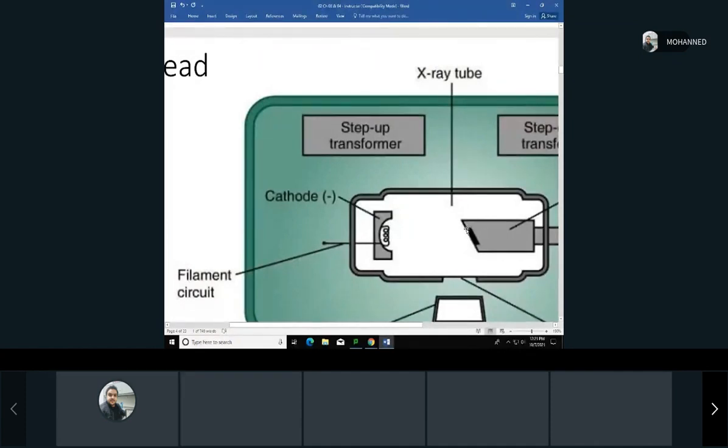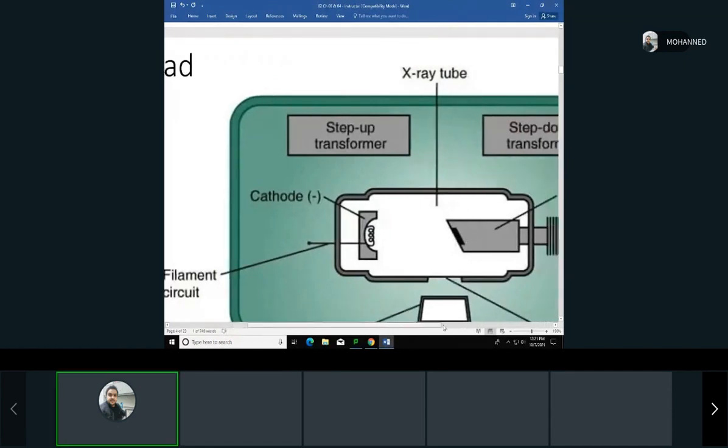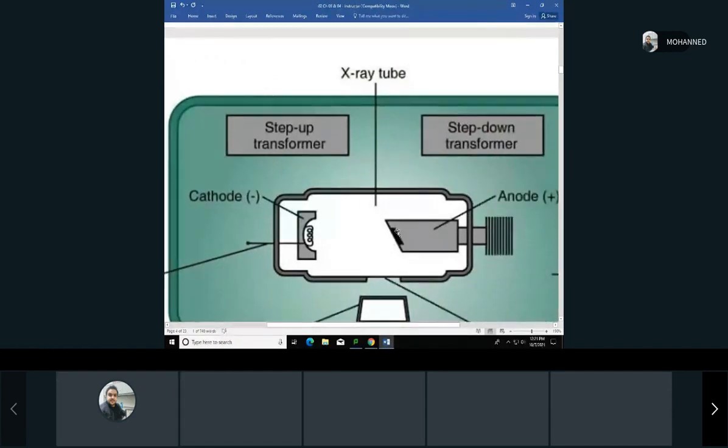The anode, right? The amount of electrons that will form here when we start the X-ray depends on the milliamperage, right? Because milliamperage is about quantity. These electrons will be flying here in a cloud, and then we will apply kilovoltage, the voltage technically, and the voltage would shoot these electrons really fast towards where? The anode, and specifically the target in the anode, which is a tungsten plate.